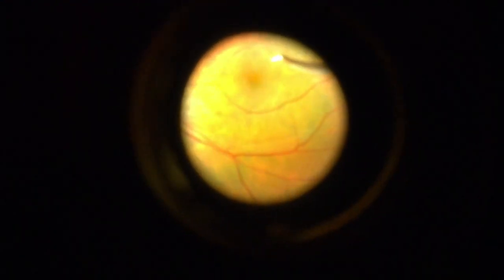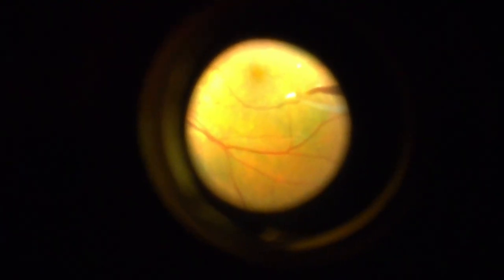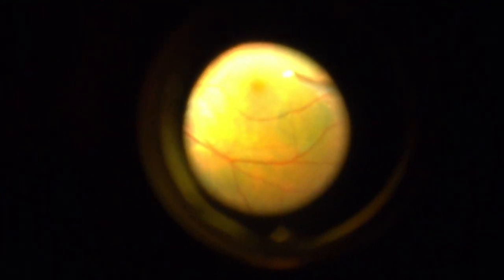Okay, so you can see here the green stain, ILM stains really green. What's not staining, where it's missing like here and here and here, these parts where it's not stained, that's the epiretinal membrane. So ICG green will stain ILM, but not ERM. If the ERM is really broad and diffuse, you get no staining at all.